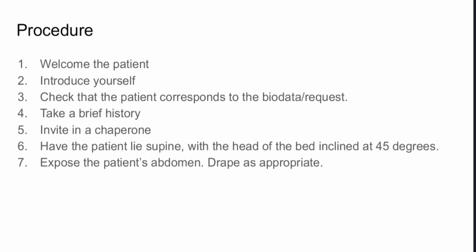Now let's talk a bit about the procedure for the scan. First, it's advised that you welcome your patient, introduce yourself, check that the patient corresponds to the biodata or request that you have, take a brief history, invite in a chaperone, then have the patient lie down with the head of the bed inclined at 45 degrees.